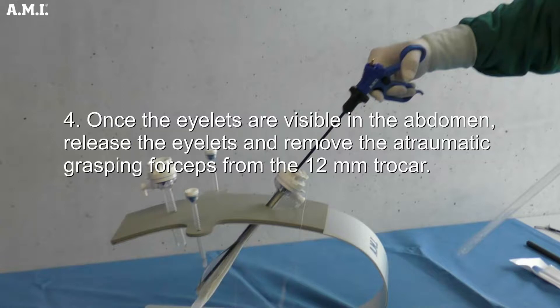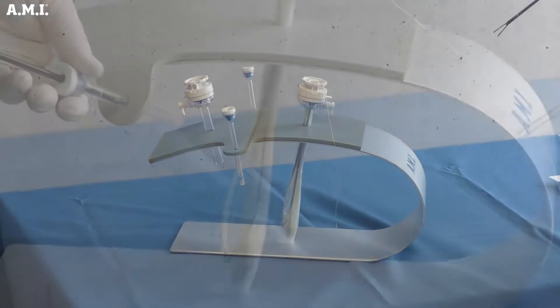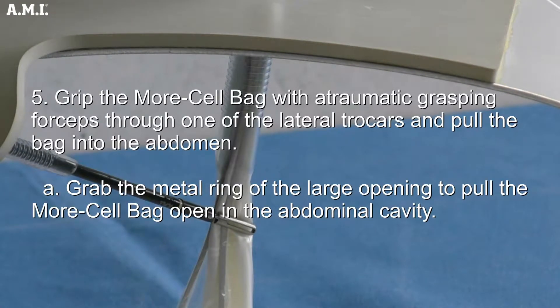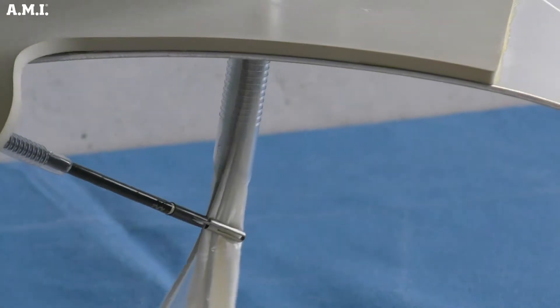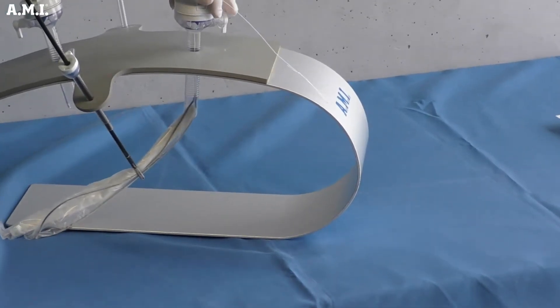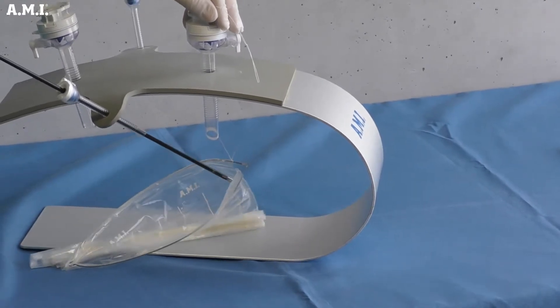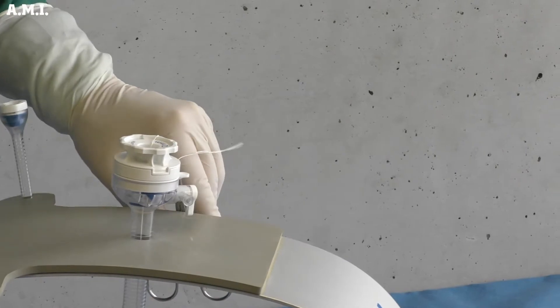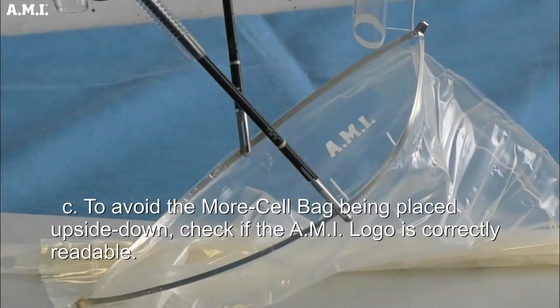Once the eyelets are visible in the abdomen, release the eyelets and remove the Atraumatic grasping forceps from the 12 mm trocar. Grip the More-Cell Bag with Atraumatic grasping forceps through one of the lateral trocars and pull the bag into the abdomen. Grab the metal ring of the large opening to pull the More-Cell Bag open in the abdominal cavity. The white loop at the end of the large opening must be visible and accessible outside of the suprapubic 12 mm trocar. To avoid the bag being placed upside down, check if the AMI logo is correctly readable.